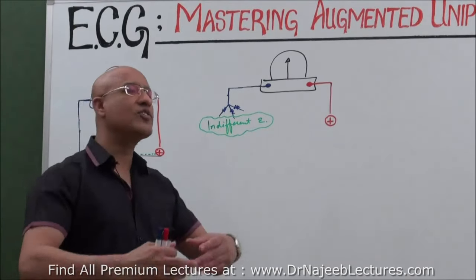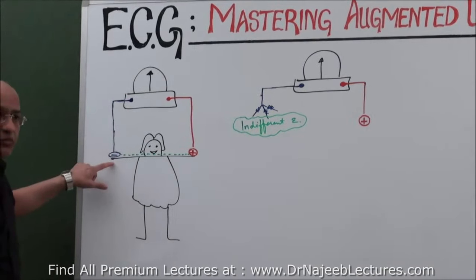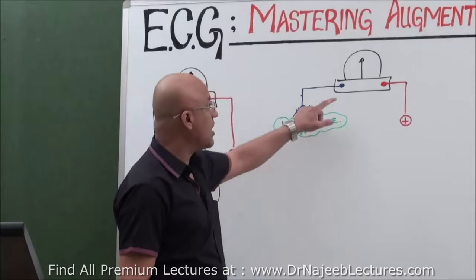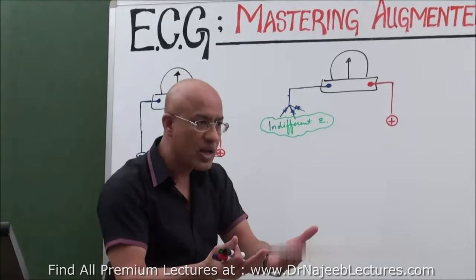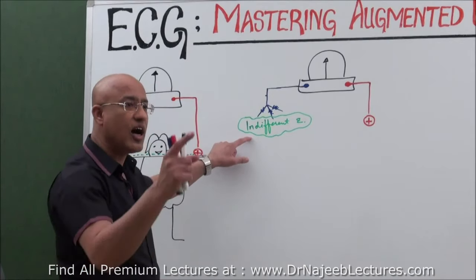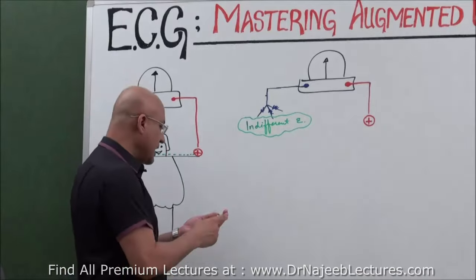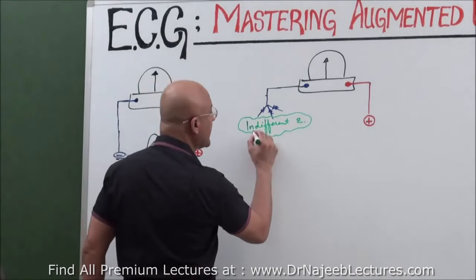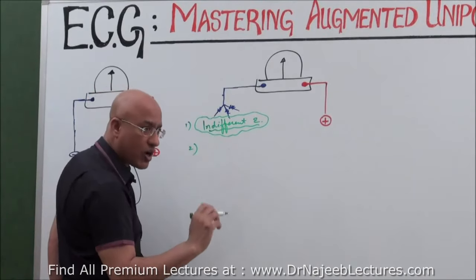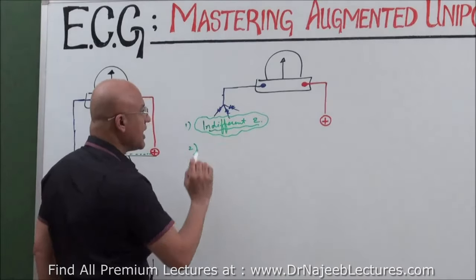An indifferent electrode is a least bothered electrode. In a bipolar lead, the negative electrode is really negative, but in unipolar leads, the negative electrode has been converted into an indifferent electrode, so that it senses almost zero potential. We also call the indifferent electrode by many names. In some books they write it one way, other books write it differently. Don't be confused. Later on I will explain how we convert the negative electrode into an indifferent electrode. Right now, just believe it is an indifferent electrode.